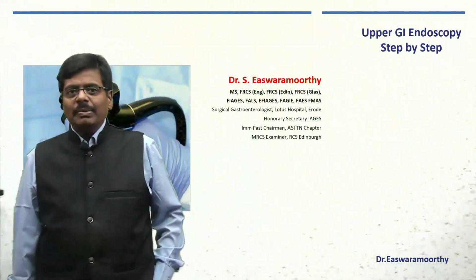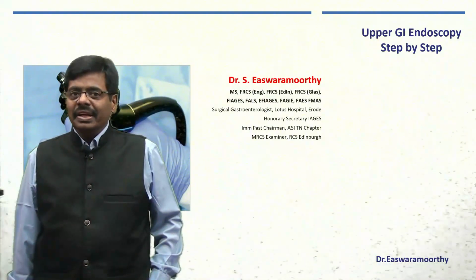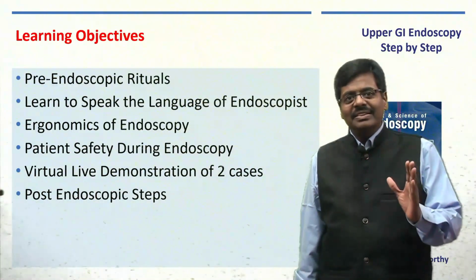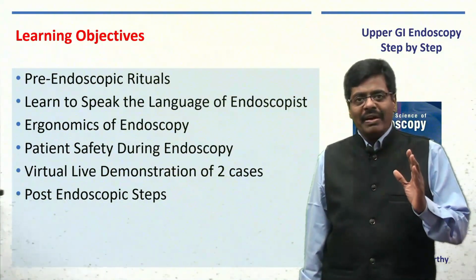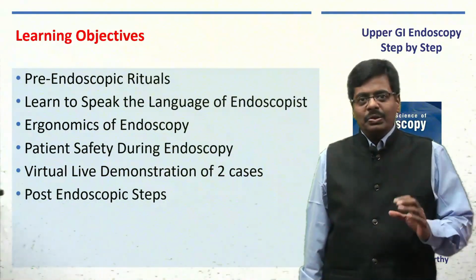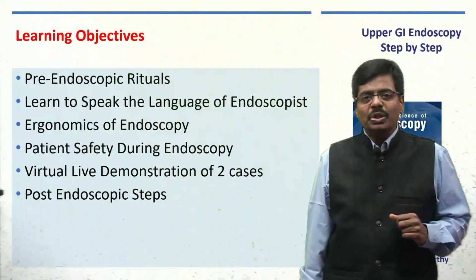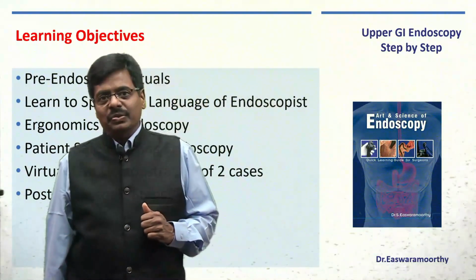Friends, flexible endoscopy training is essential for every surgeon in this era of minimal access surgery. You all know that. Here today, like the first class in your driving lesson, we are going to tell you the very basics for you to navigate through the upper GI tree using a gastroscope, by showing the basics that postgraduates or trainees should understand, and also by means of two virtual live cases I am going to describe all the key steps of upper GI endoscopy.